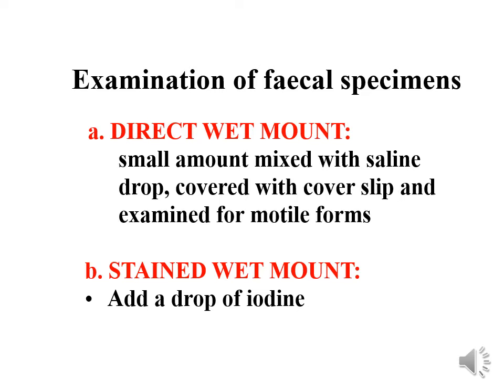This can help you to identify the motile or moving forms of trophozoites, if it is a hot or recently passed stool.